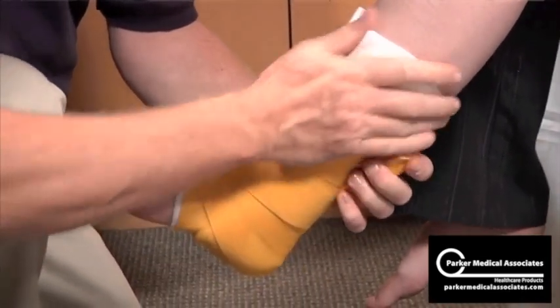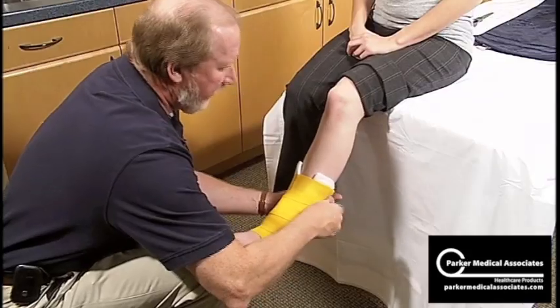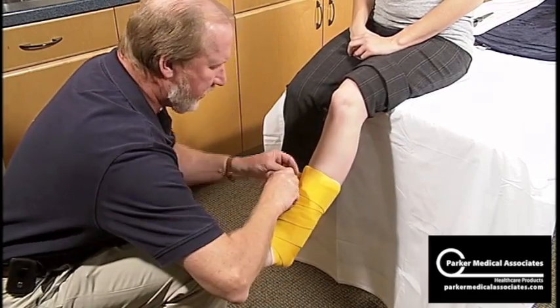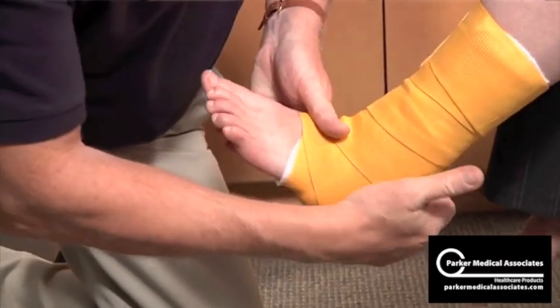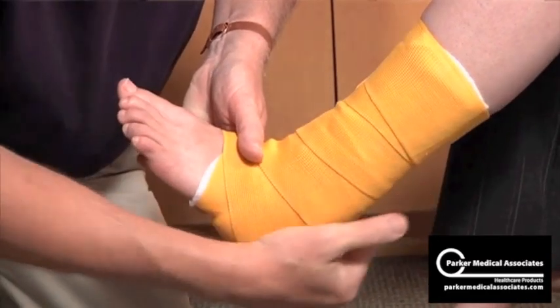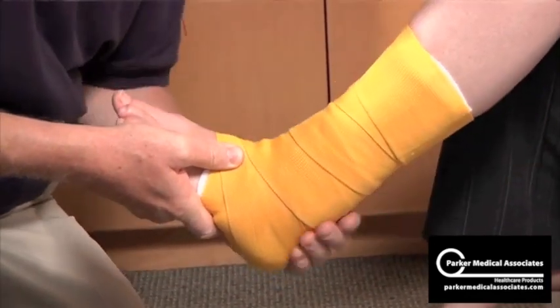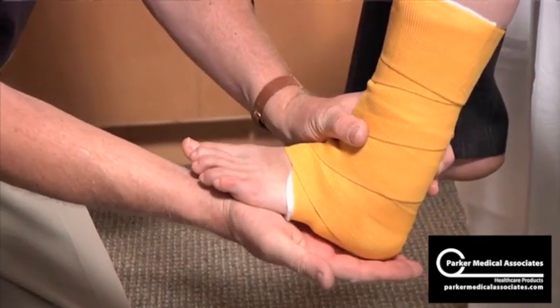And this is a nice, really cost-effective ankle stirrup. It's low profile, so it fits in most shoes. Just mold it and place them on the floor to maintain that 90 degrees. This is what we use for an ankle sprain, particularly a grade one ankle sprain. This is the ankle stirrup.